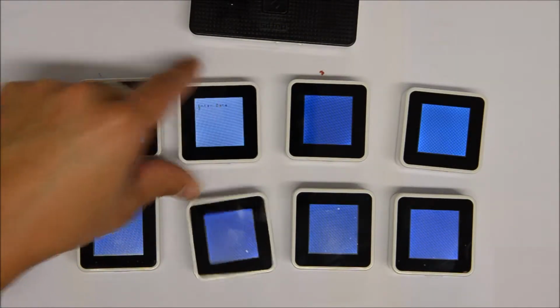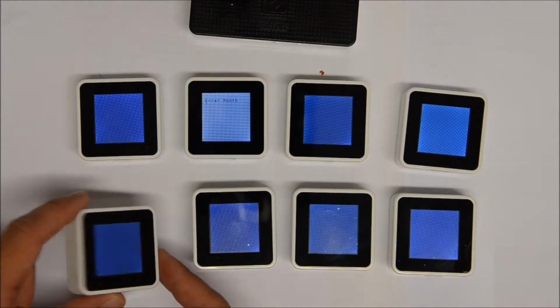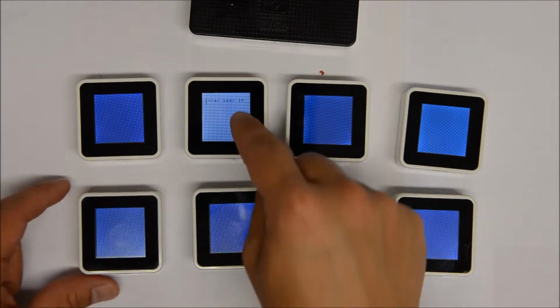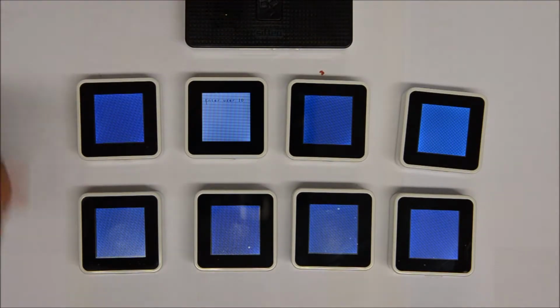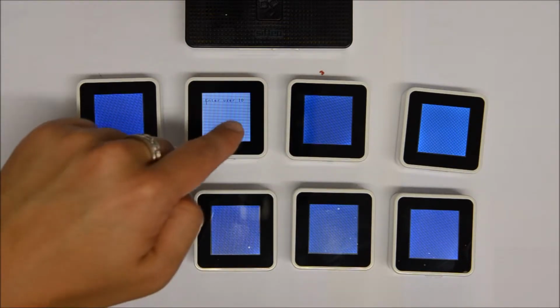Entering a date, you can tilt to the left or to the right: to the left with minus, to the right with plus, negative numbers for testing purposes, and then also the month and the user ID. After this step, it will load the task, and what this unit will do is use the speakers in here. It will speak out the instruction in French for each of the tasks, and it will display the images containing each of the items correspondingly which have been loaded.